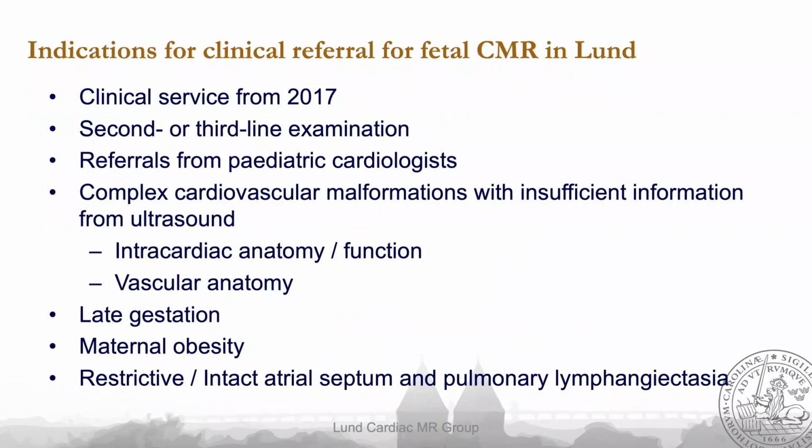Great. So thank you very much for inviting me. As an overview, we started out with a clinical service in autumn 2017, with reimbursement since. And we still see CMR, and probably will for the future to come, as a second or third line examination, where the patient has always done at least one dedicated fetal echo before coming to us. We mainly see the referrals from pediatric cardiologists, seldomly from the obstetricians.